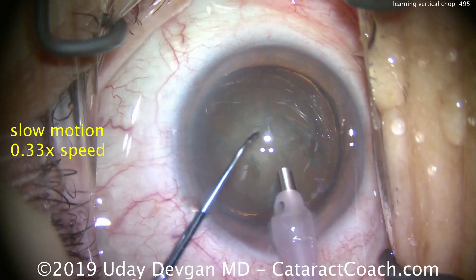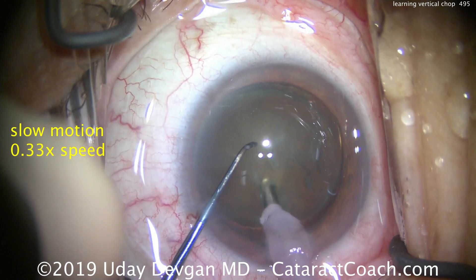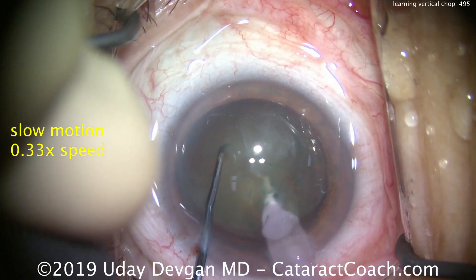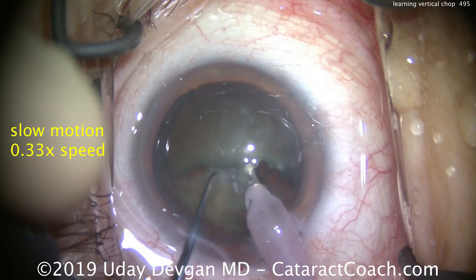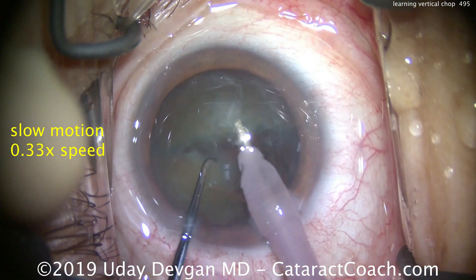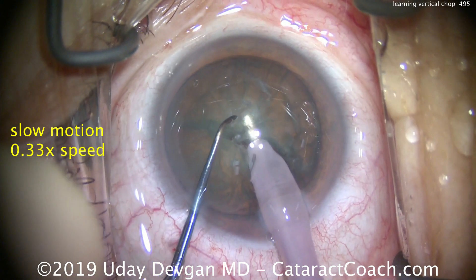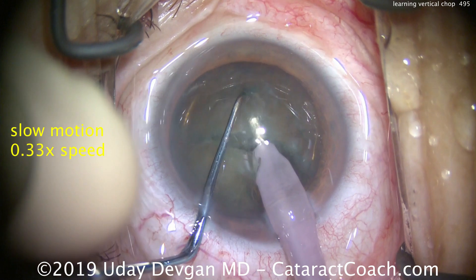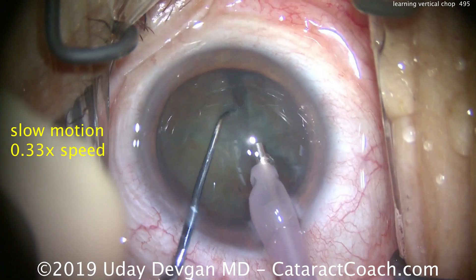It's the same case — I'm just showing you in slow motion. Look where the chopper and the phaco probe go. The probe is sub-incisional, not in the center of the nucleus. The chopper goes inside the nasal capsulorhexis. They're dug in deep, brought together, and pushed apart, with a little extra effort here to propagate that chop all the way through. Then buzz in again — chopper goes into the nucleus and the instruments are brought apart.